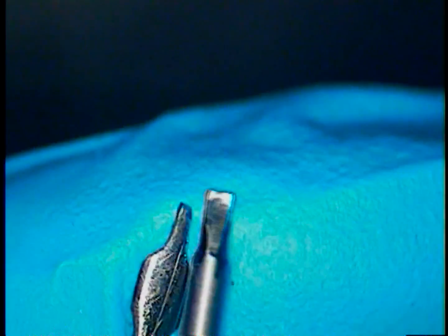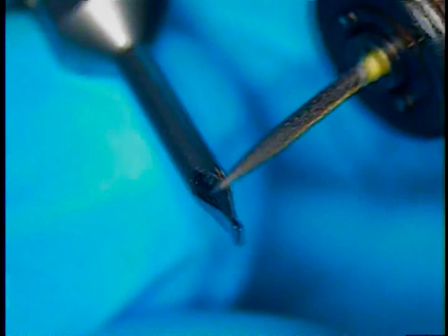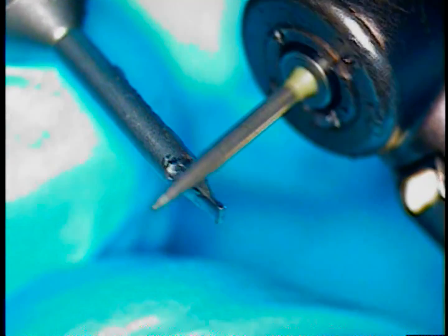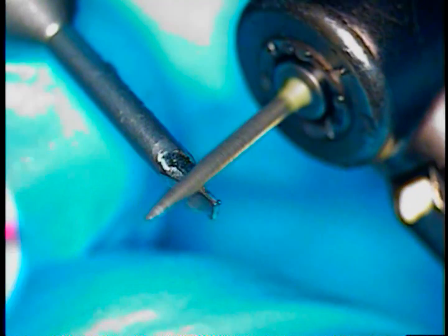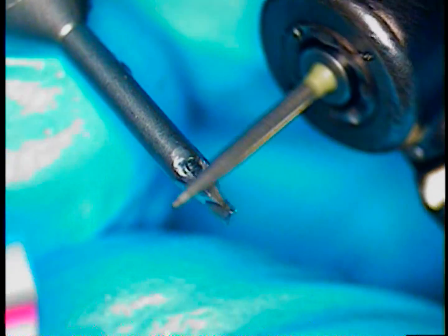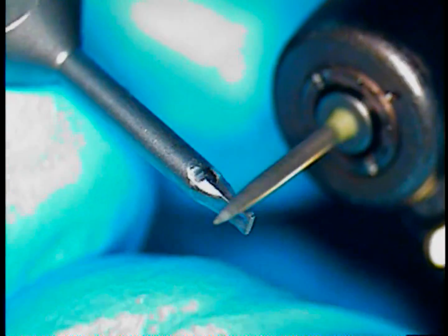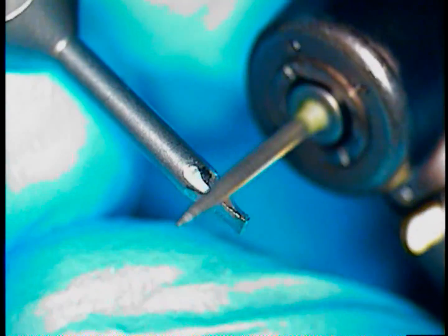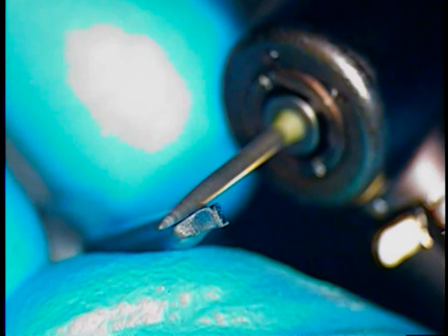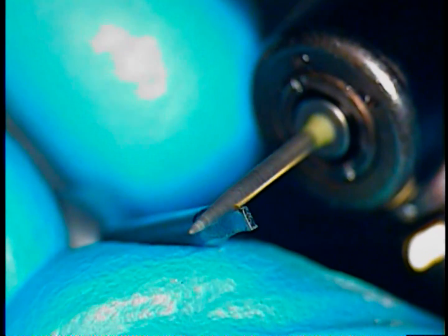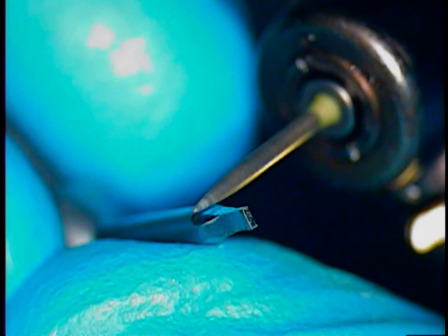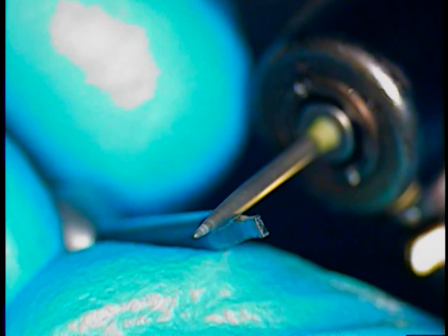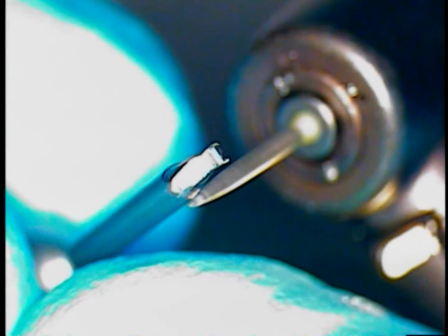And this is the other instrument that I used. And I'm comparing the widths now of what I used in the past and trying to go with a stronger metal. So why not just take the implant driver itself and take a fine diamond with some water and just hone the tip of the driver. So I'm working against the flat end, trying to reduce the overall width. I believe this driver belongs to a Camelog kit. So you can grab some instruments from other kits, see whatever works when you have a challenge case like this.